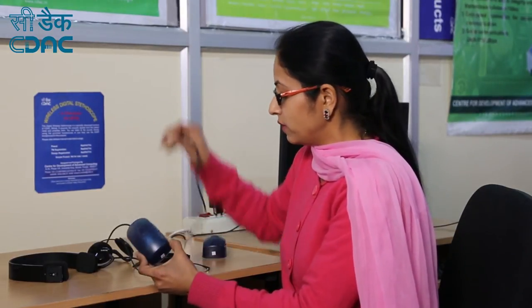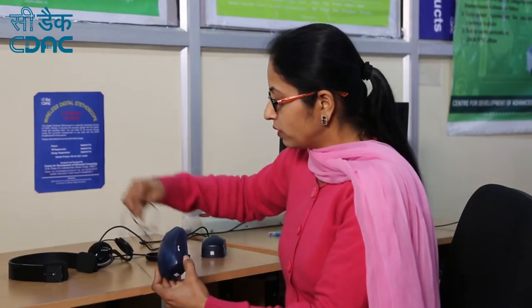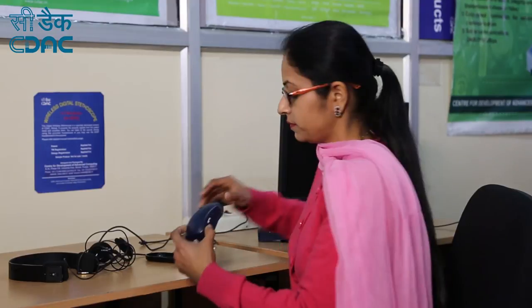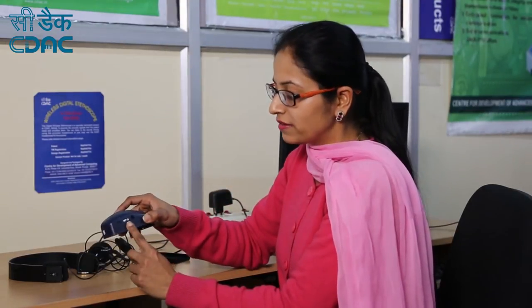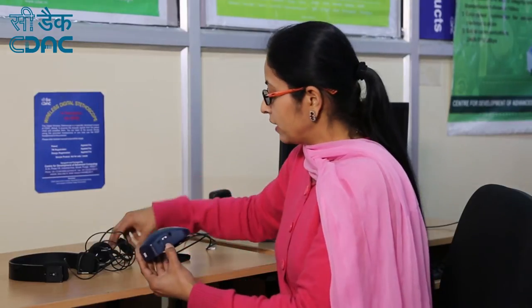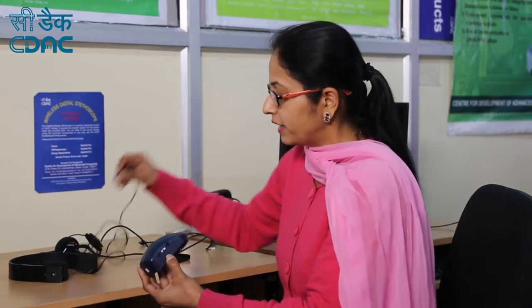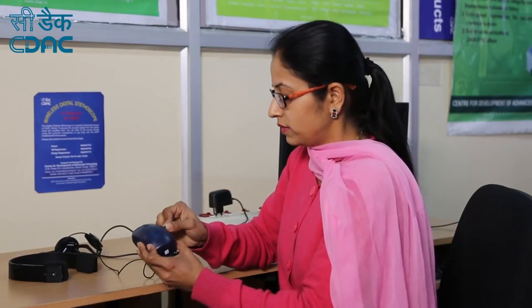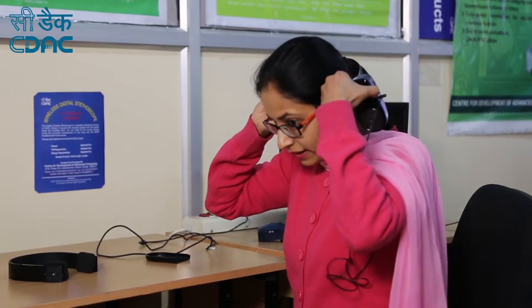Now, how to connect the wired headphone with the device. First, put the slider switch to its off position. Connect one end of the wired headphone to the audio jack, and put the wired headphone around the head.